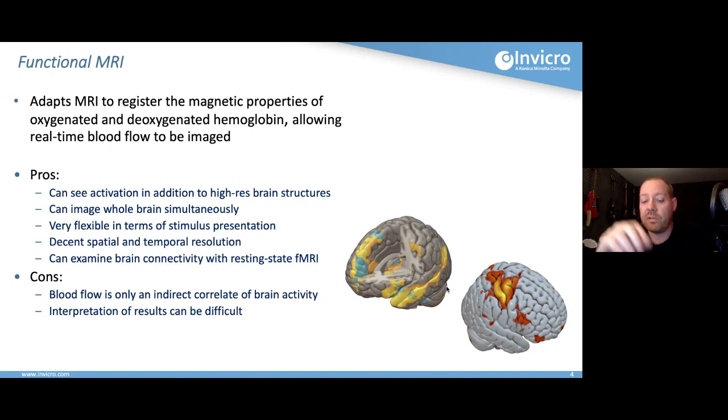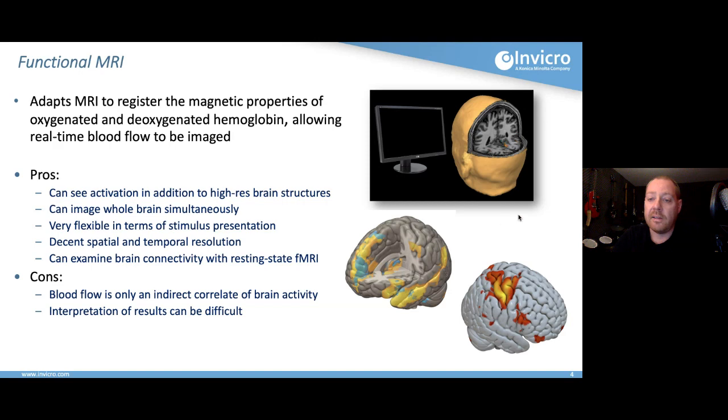You can do visual stimuli, like this little simulated experiment I've got up here. That's actually my brain and my activation data in that little animation. You can do things like pain stimuli, you can do smell, you can do audio, you can do really much anything you like. Can be adapted to do in the MRI scanner, with a few exceptions.